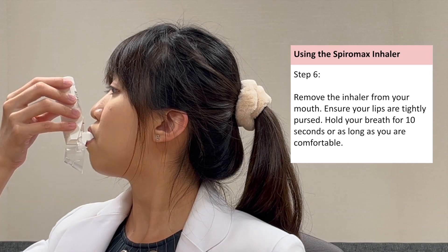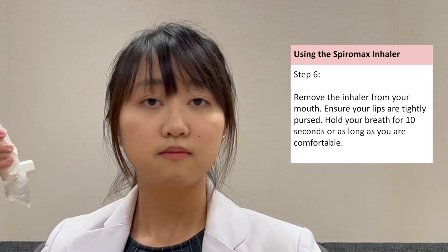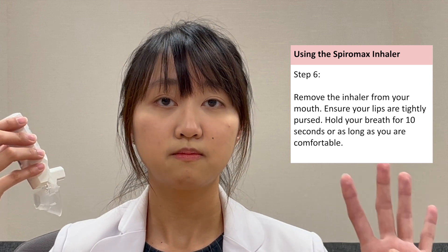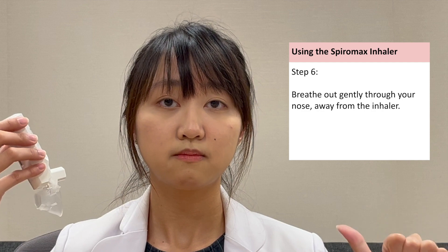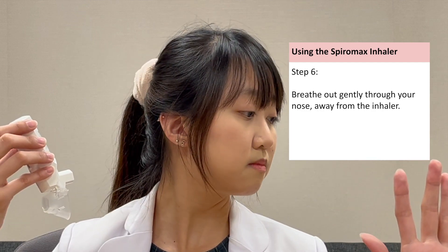Remove the inhaler from your mouth. Ensure your lips are tightly pursed. Hold your breath for 10 seconds or as long as you're comfortable. Breathe out gently through your nose away from the inhaler.